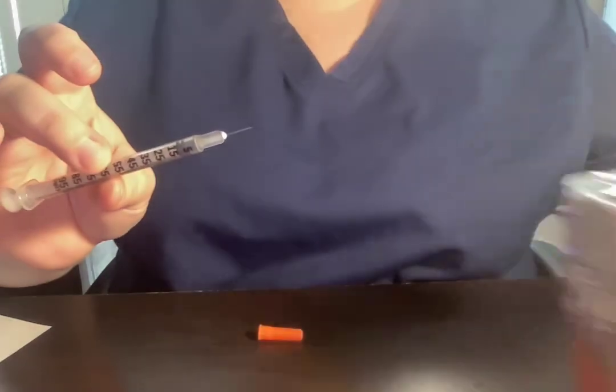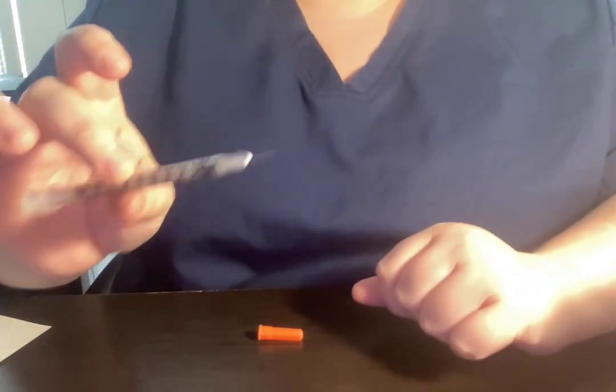I would throw away the dirty needle in the biohazard container. I would then remove my gloves, wash my hands, and document.